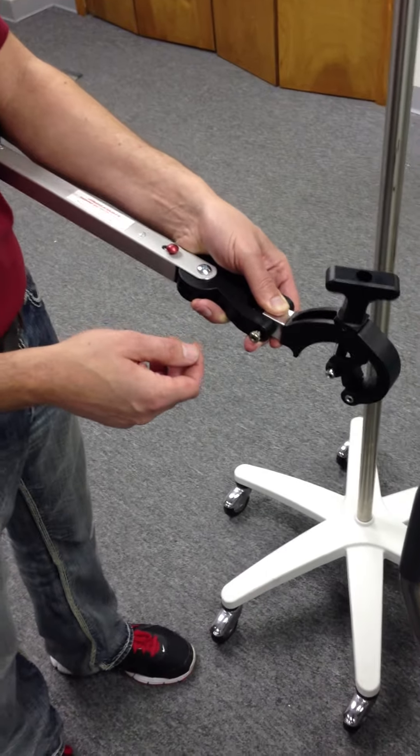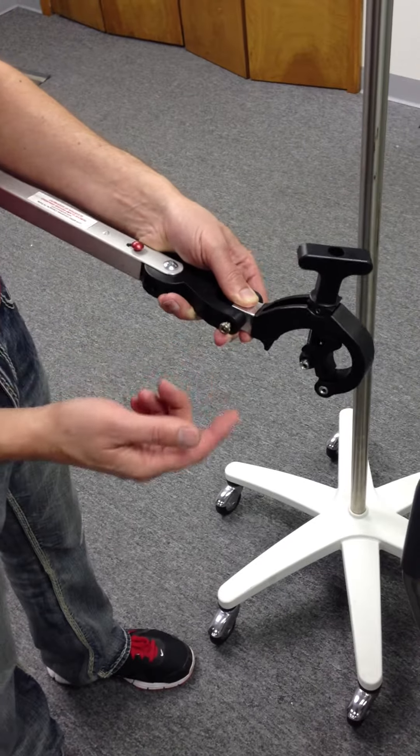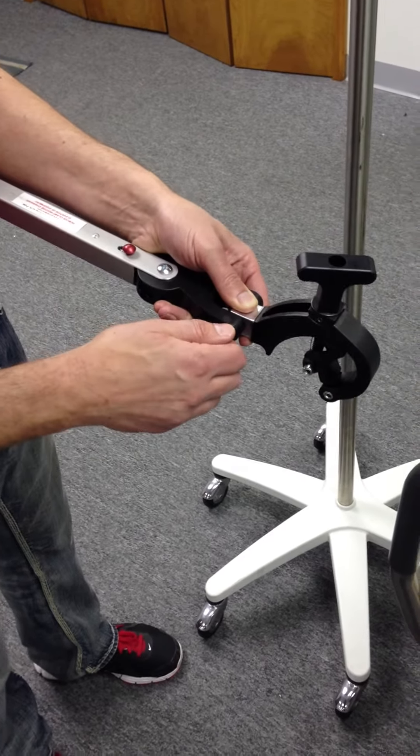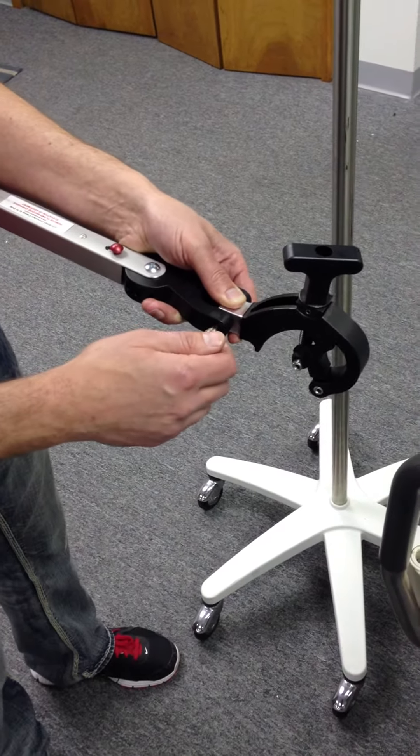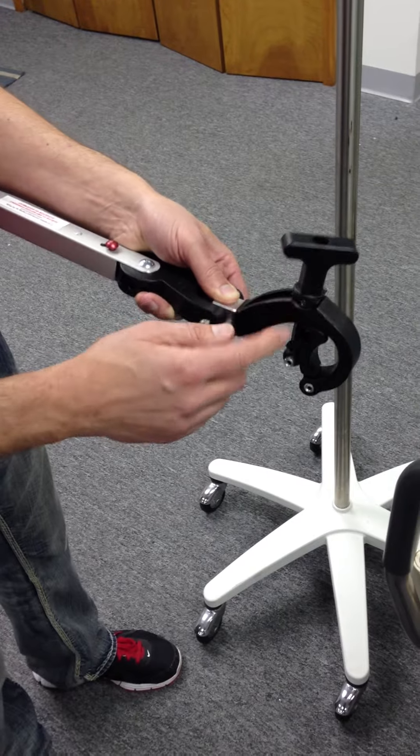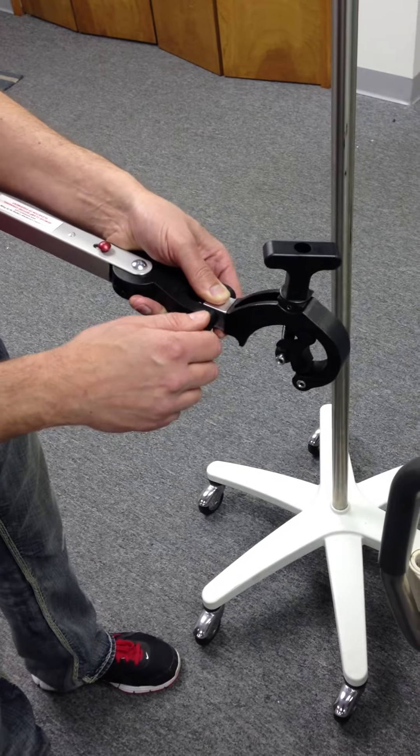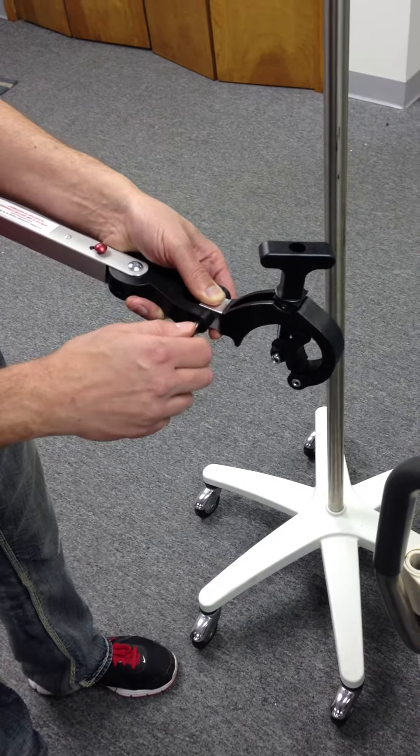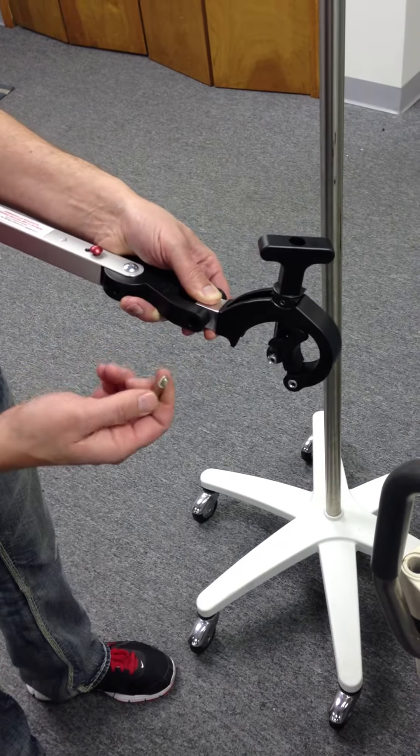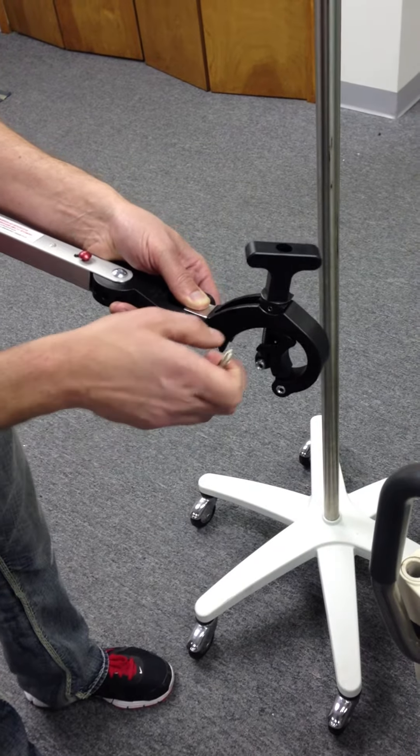Alright, here is the CH6000 universal clamp. I'm going to show you how to turn the clamp itself 90 degrees.